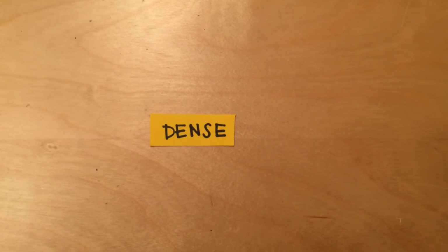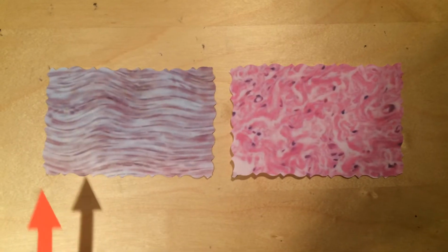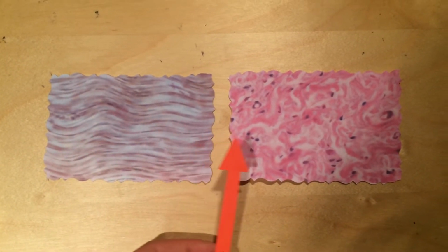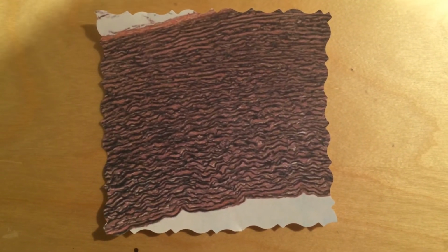Dense connective tissue includes regular, irregular, and elastic. Regular dense tissue is very uniform. Irregular dense tissue is not uniform, with crazy fibers, and elastic is dark and wavy.